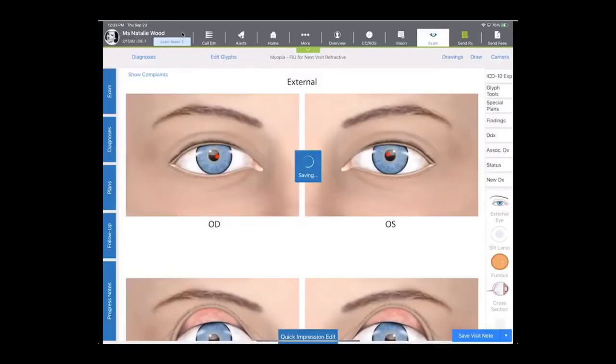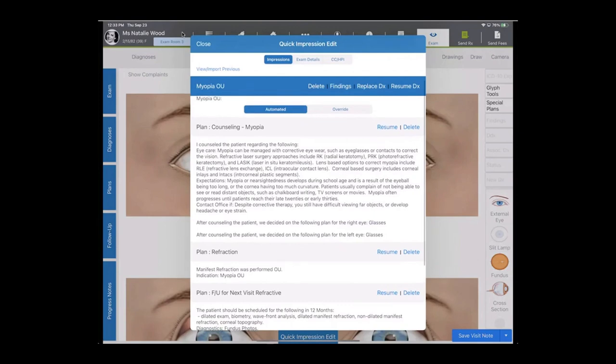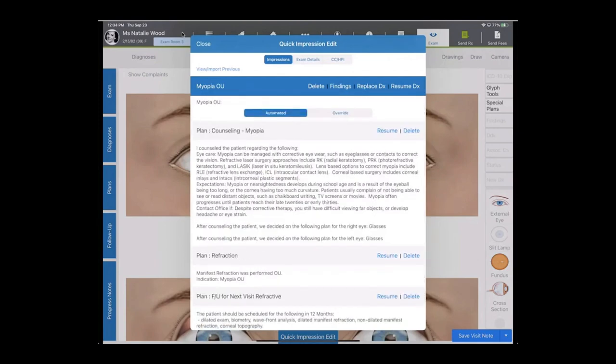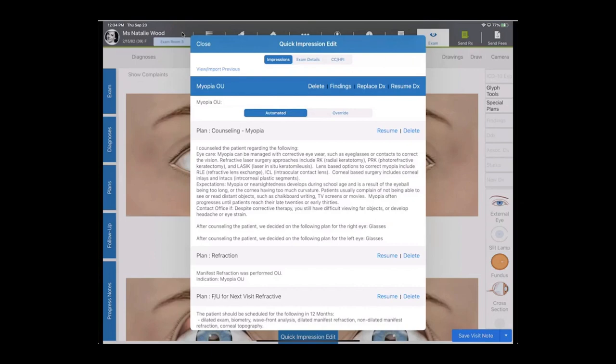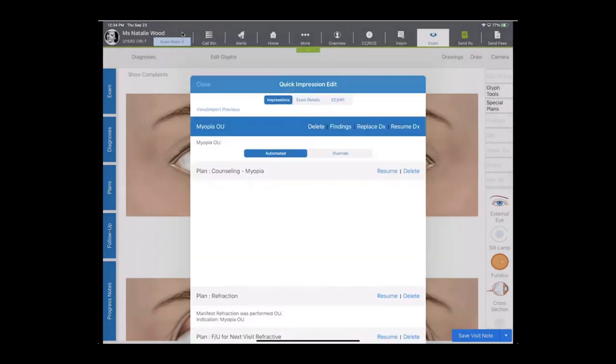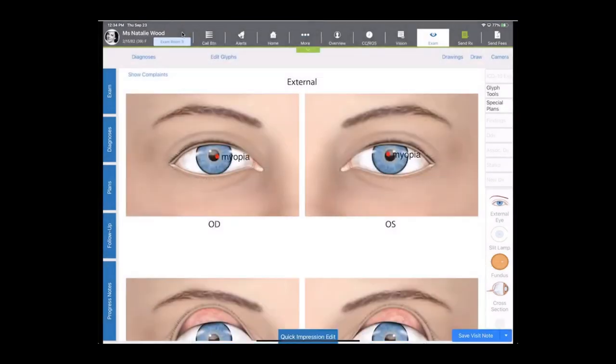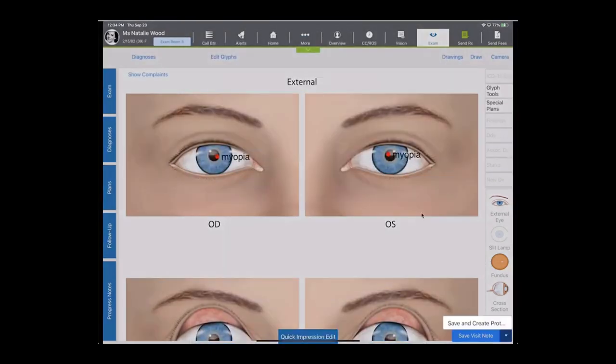And you can see down here at the bottom, just in about four selections, I've made a really nice formal documentation with just about four selections. That was fast, but I'll tell you that we can even make it faster than that. So if you wanted to save this entire documentation for the future, in this particular case, myopia OU with counseling or refraction and a follow-up, you can save this entire documentation to use again and bring it into the record for a patient in one click. And so down here at the very bottom of the screen, you're going to see a save and create protocol button. You can save and create any protocol from any documentation you would like and use it again in the future.